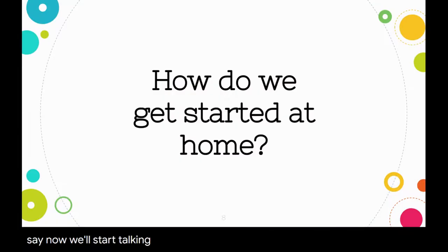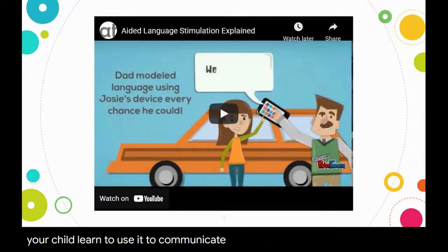Now we'll start talking about how you can use the device at home to help your child learn to use it to communicate. The best strategy we can use to support a new AAC user is what's called modeling. This short video will give us an idea of what it is and why we do it.